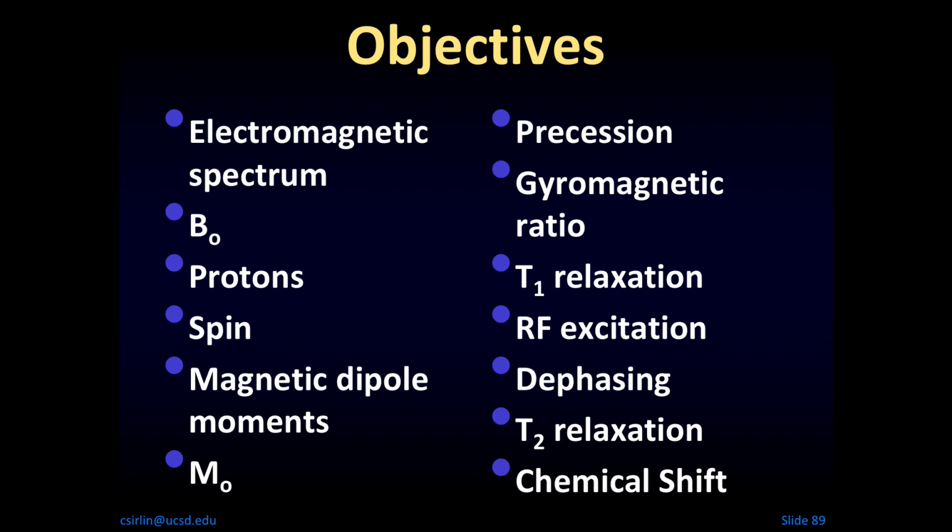Different tissues have different T1 relaxations. The tissue in the abdomen that has the fastest T1 relaxation is fat, and then pancreas, and then liver. And the thing that has the slowest T1 relaxation is pure water. The spleen has a long T1 relaxation, but not quite as long as water. And the T1 relaxation of spleen is about the same as the T1 relaxation of a prototypical metastasis.